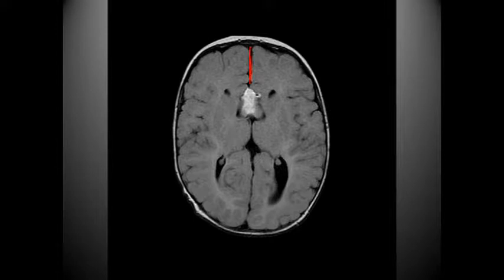You'll notice in the center, in the midline, we have basically the frontal horns of the lateral ventricle, the occipital horns of the lateral ventricle, the third ventricle, and we have this area here, which is a lipoma. Lipomas quite often are located in the midline in the brain, usually in the longitudinal fissure. That is where we see a lot of lipomas, and this is a lipoma in the brain. Lipomas are not necessarily just segregated to being in the abdomen or in the extremities, but they can be in the brain as well.